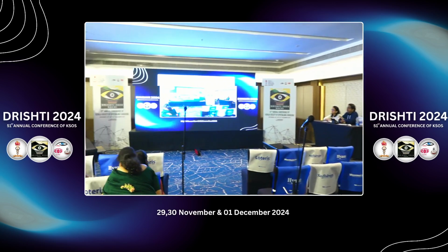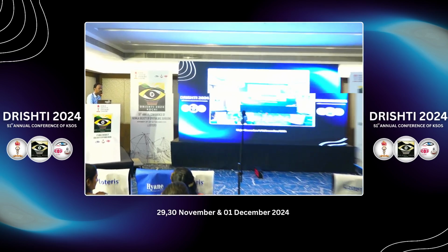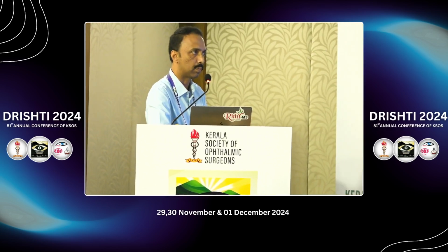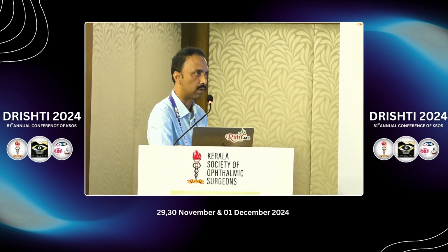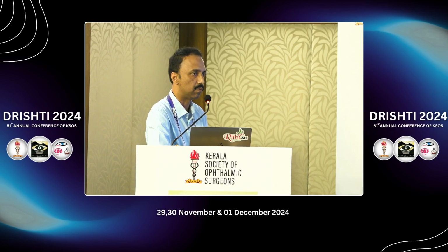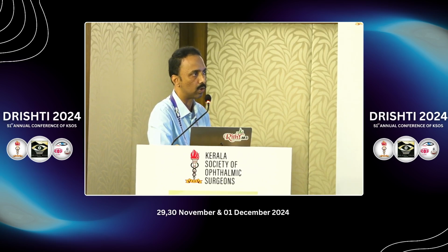Now, if the problem is getting a good OCT picture in the setting of a cataract, if I get a good OCT picture, I would definitely look at the biomarker signs. If there are a lot of hyperreflective foci, if I see a lot of turbid intraretinal fluid, then these are signs which tell me that steroids may be beneficial, because anyway we're going to remove the cataract. So this problem of steroid-induced cataract is not there. It's only the glaucoma. So if the patient is not glaucomatous and has no family history of glaucoma, then I would use these signs to decide on steroids over anti-VEGF.